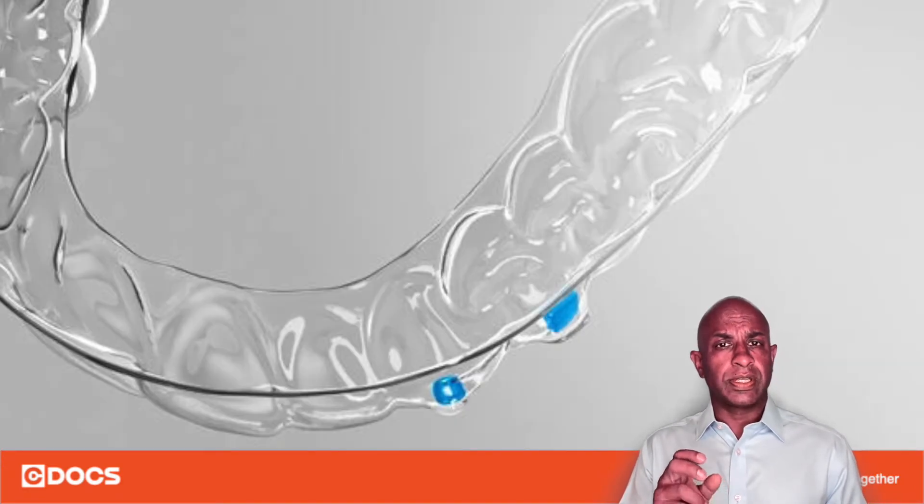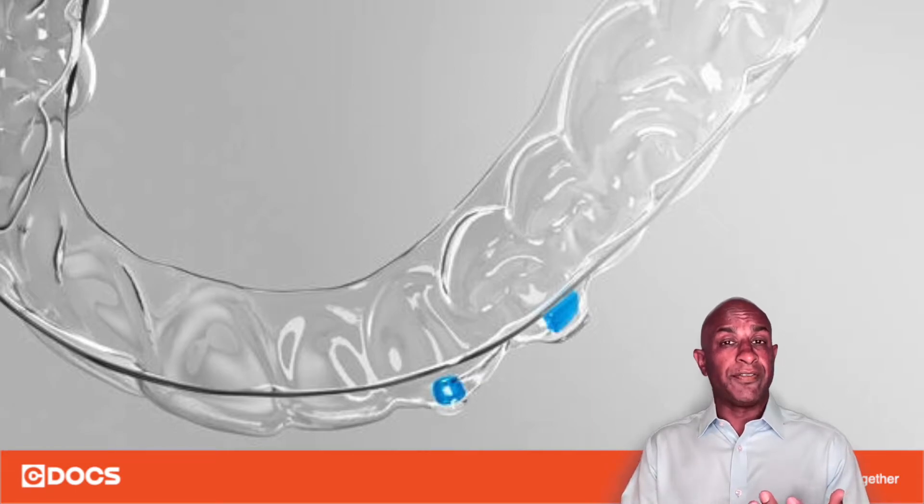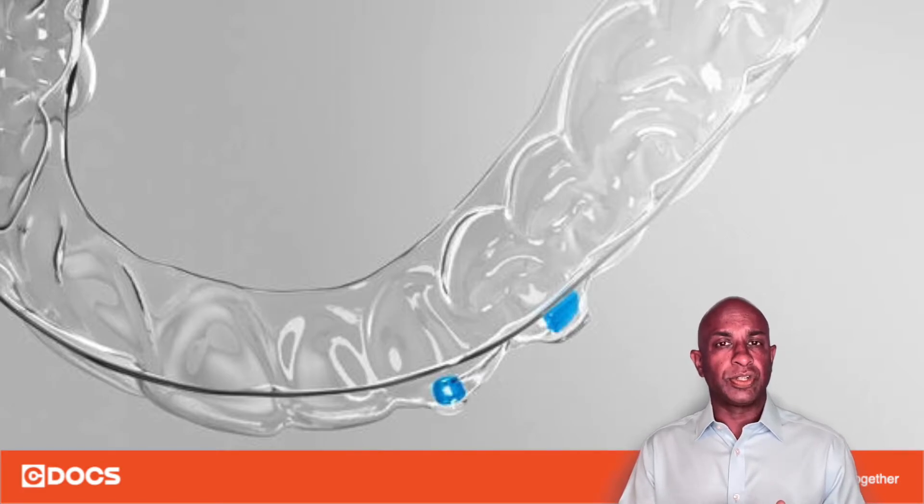Inside each of those negative wells you want to take a very thin coat of Vaseline to ensure that the adhesive does not bind to the tray when you're curing it to the teeth, and then you want to load it with the composite of your choice.